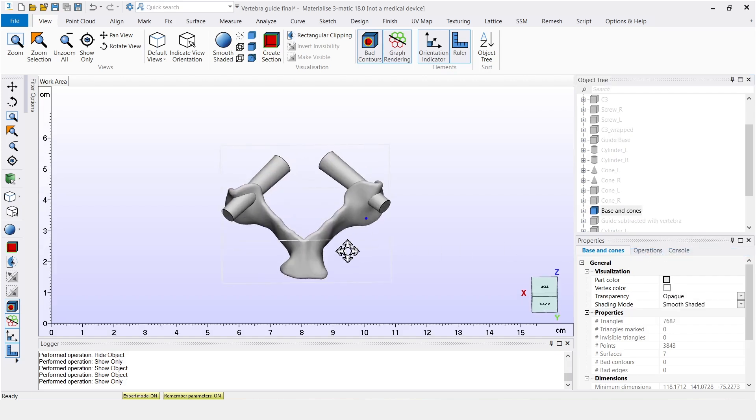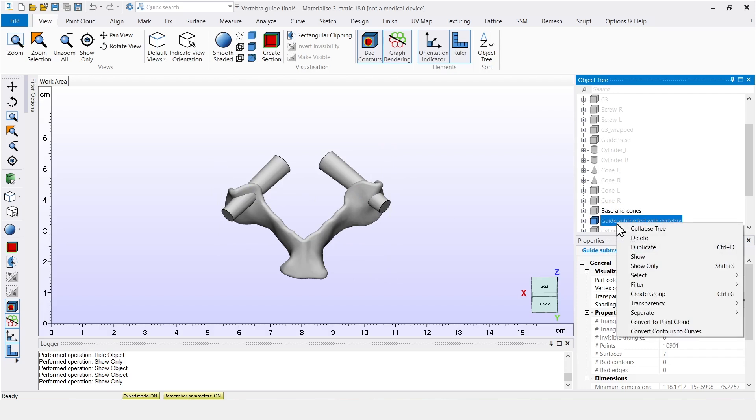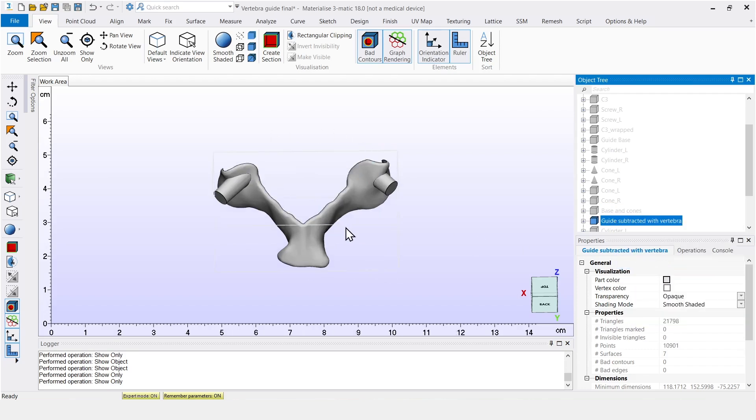Now, because the cones are still protruding from the back of the base, we can use the vertebra to subtract them from the guide. And this is what we then end up with.